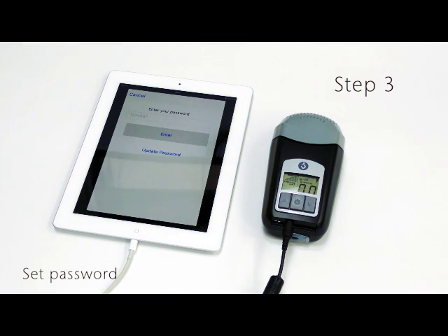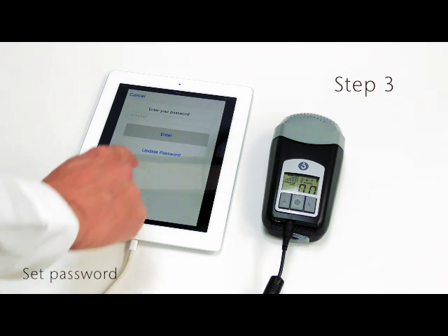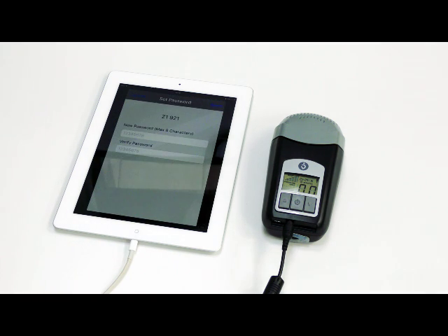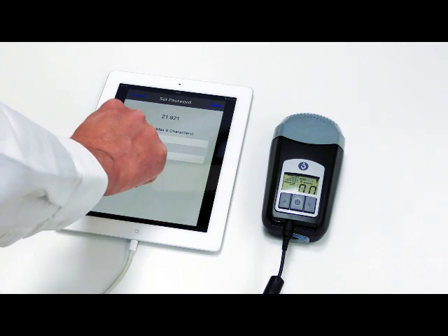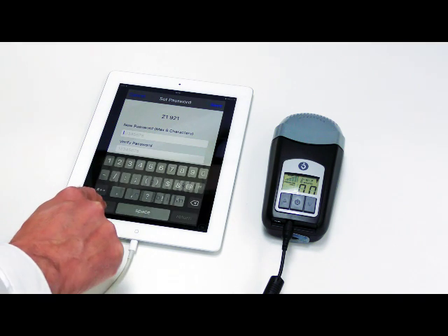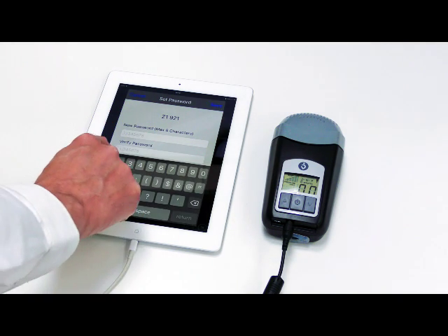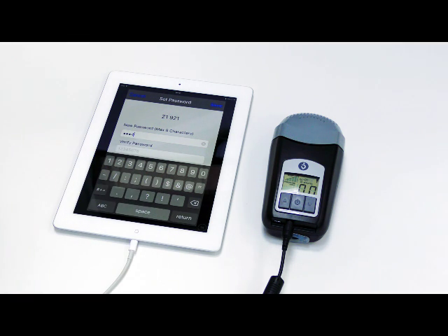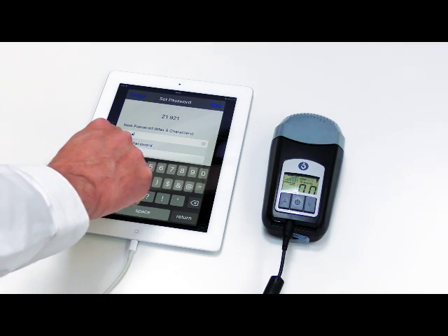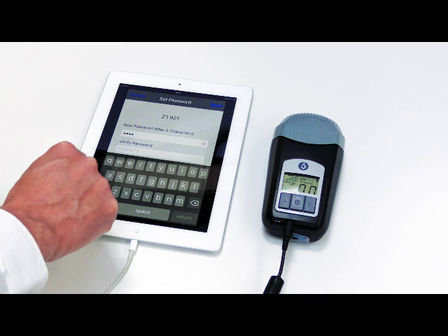Step 3: Set Password. Press Update Password. Press the white bar under New Password. Use the keypad to enter a numerical code that you will remember. Re-enter this code under Verify Password. Press Save.